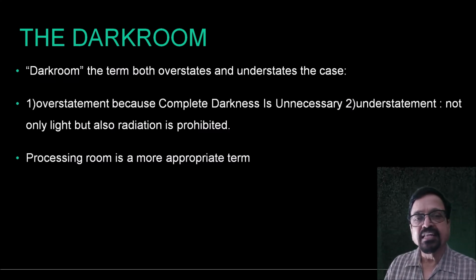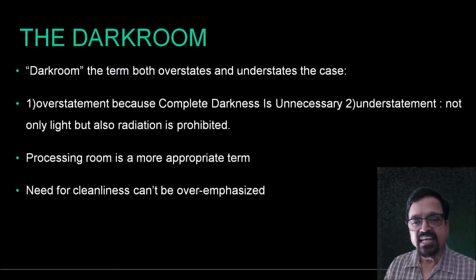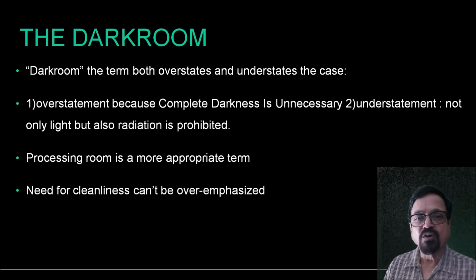Therefore, the name we suggest is the processing room rather than a dark room, since it suffices this purpose also. It clearly states what it does, and it really means what we are doing in the dark room, that is the processing. And this also needs cleanliness and certain ventilation facilities, because the persons are working in a dark room for a long time.